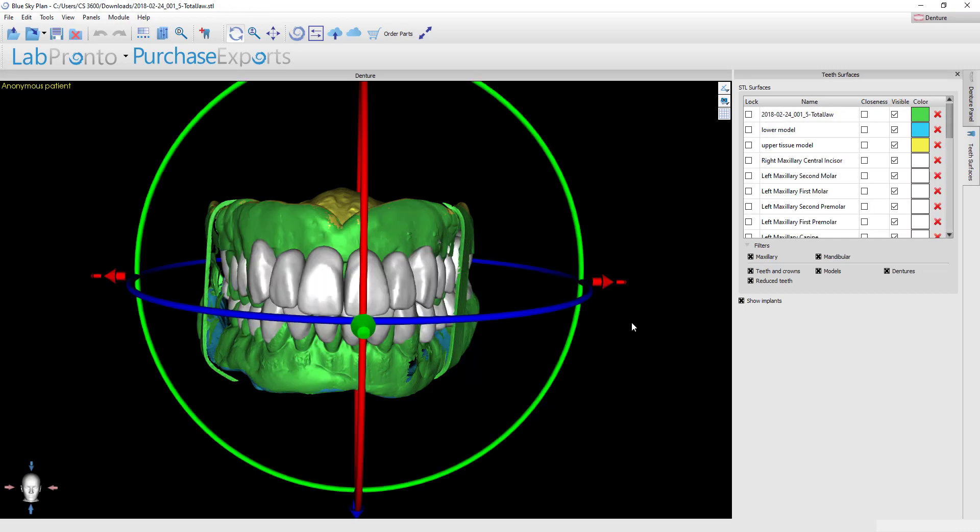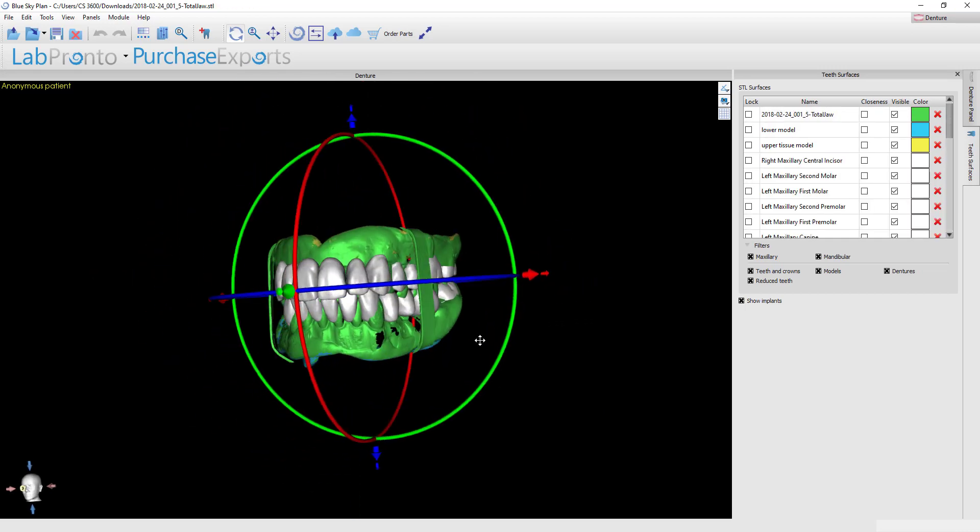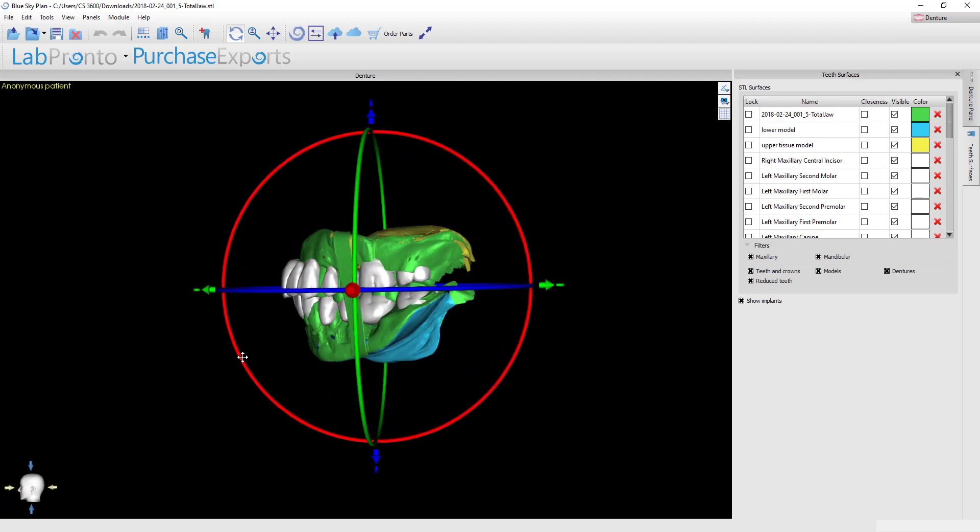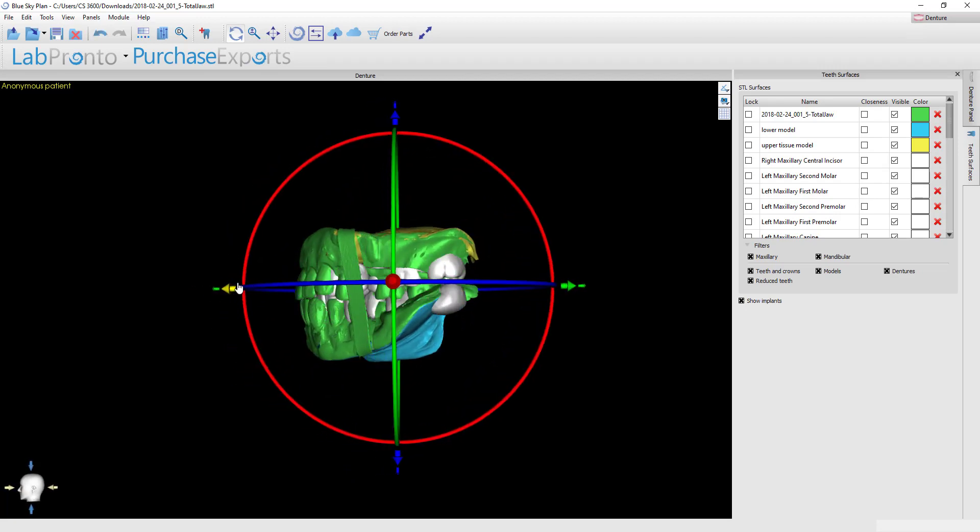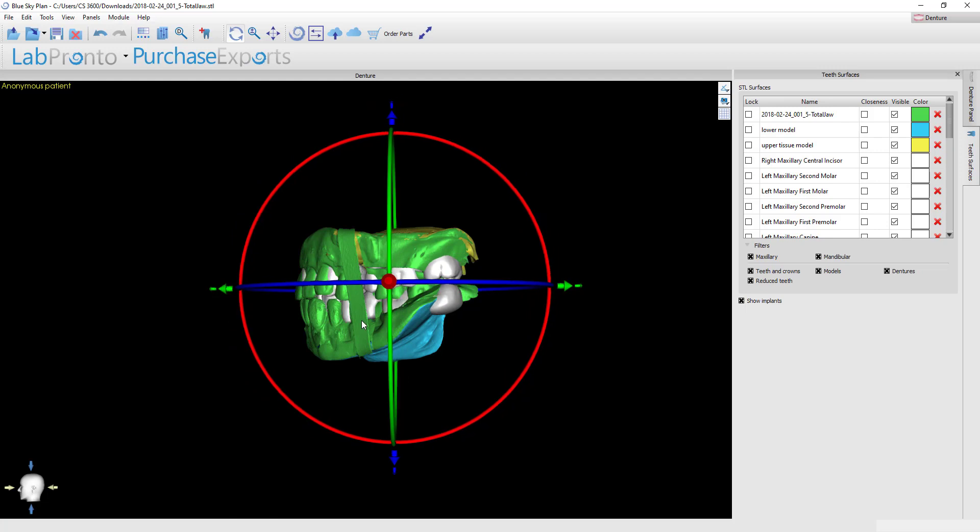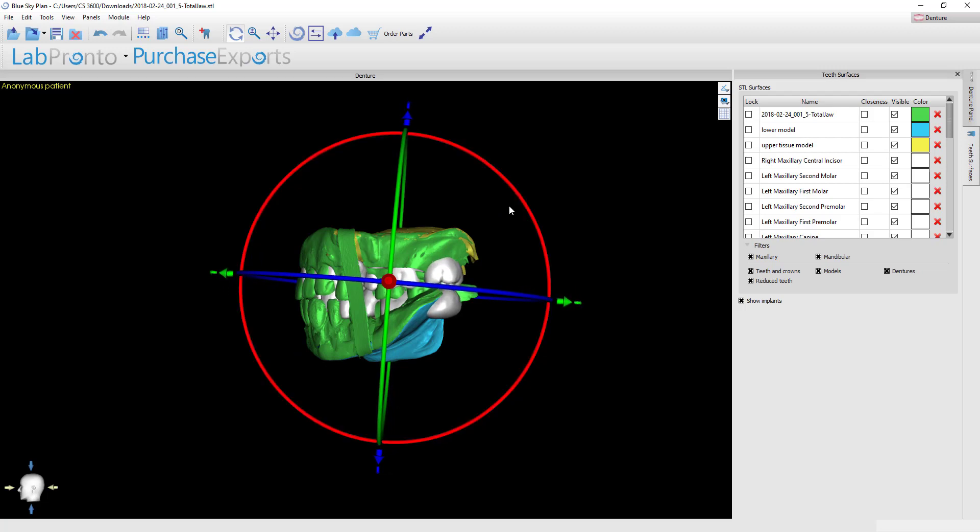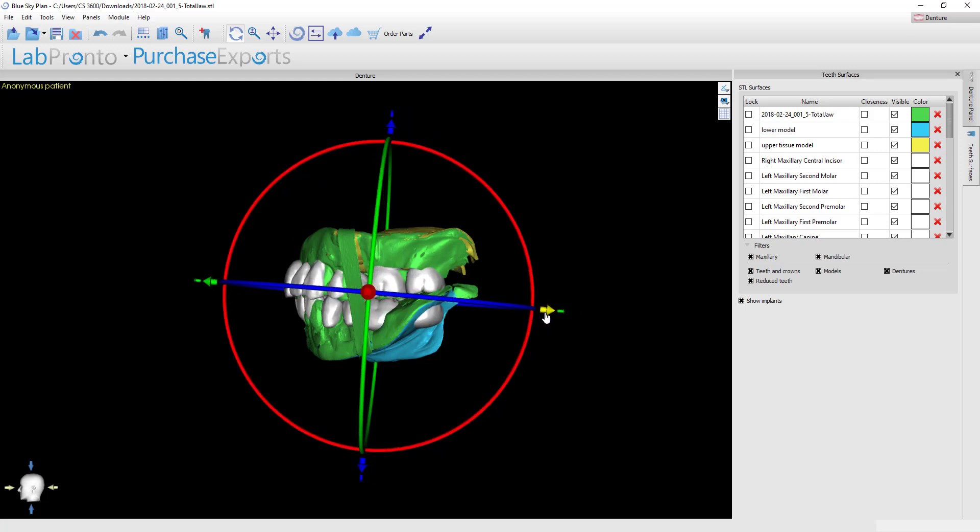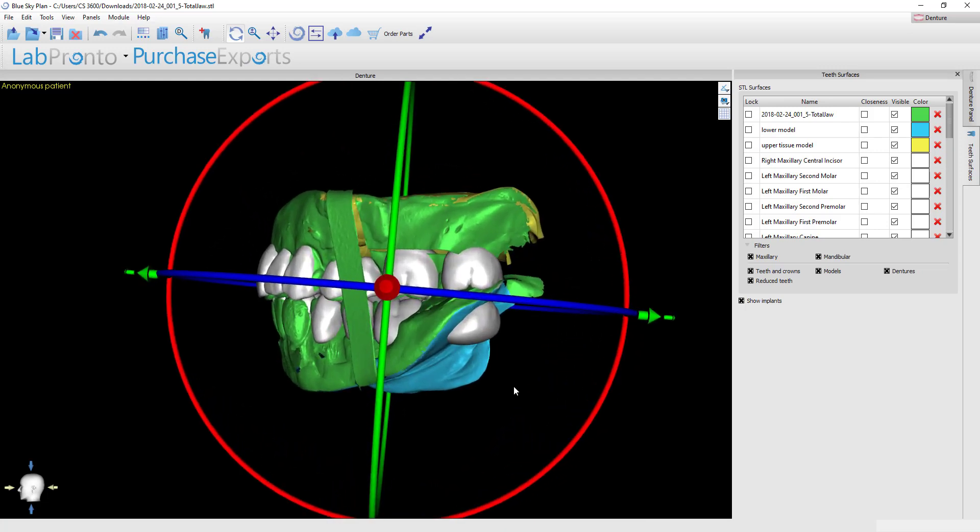Here you see that the teeth have been dropped in and it will automatically default to have this widget available because you can globally position the entire dentition within the case. Unique to this patient we're going to try to align the new teeth to his current set of dentures. We had already determined that was an acceptable VDO and the tooth positions were pretty good.